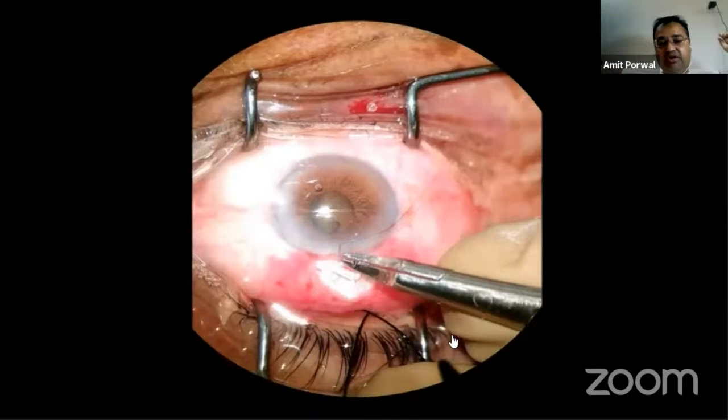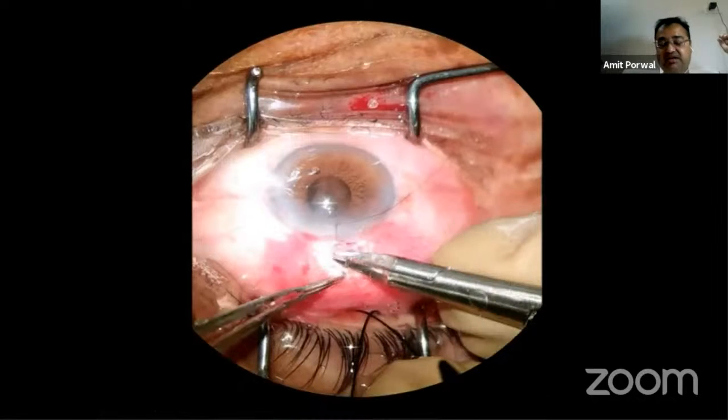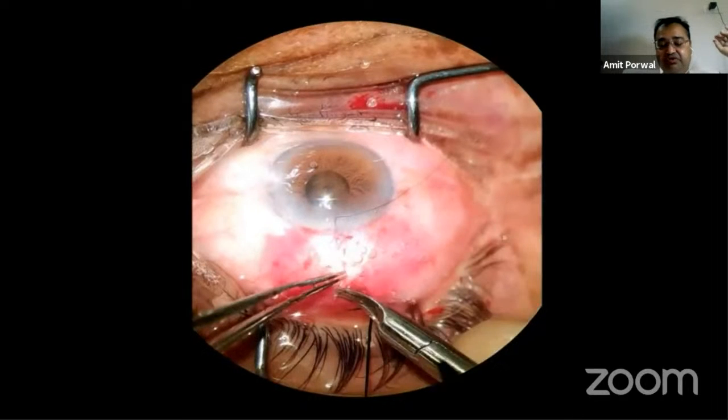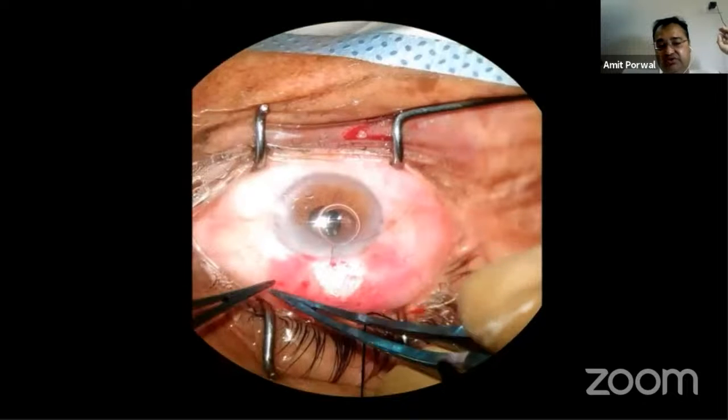What is more important is how you do the surgery? Meticulous planning has to be done. Your tissue handling should be very nice and delicate and gentle. Your cautery should not be a vague, diffuse cautery. You should identify the bleeders and cauterize only those.